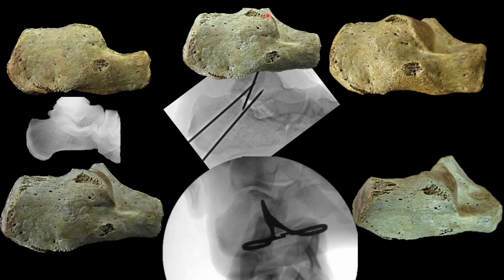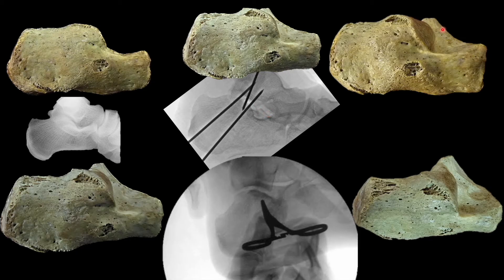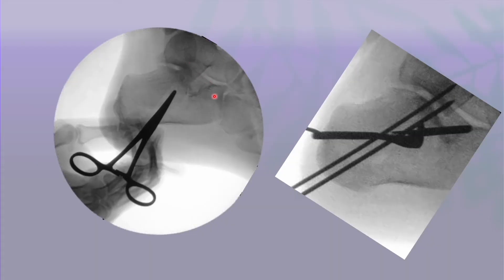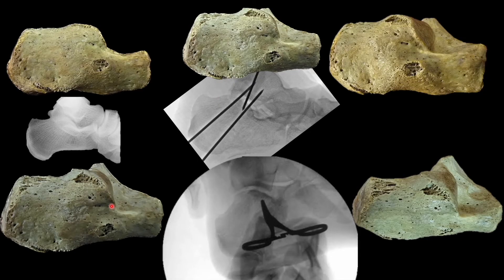Confusion occurs because of the various degrees of tilt in the lateral position. When you get a perfect lateral view, you will see only the posterior facet and there should be no sustentaculum tali line visible, because the fluoroscopic beam is passing perfectly parallel to the posterior facet. When you do slightest external rotation, the medial part comes into the way of the fluoroscopic beam and this line becomes visible. By doing an internal rotation maneuver you can get a good lateral radiograph in which no line is visible over the posterior facet, because the sustentaculum tali is hidden behind it. With slight external rotation you can appreciate the sustentaculum tali line, and with further external rotation it becomes more prominent.